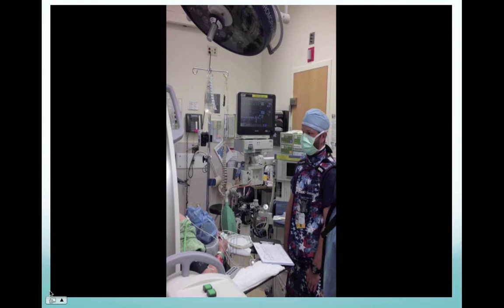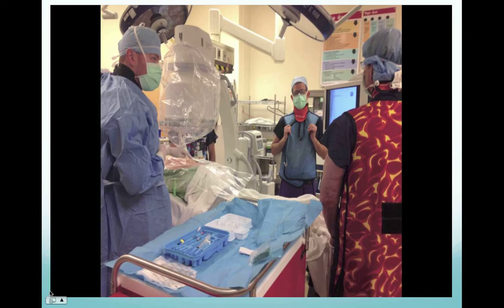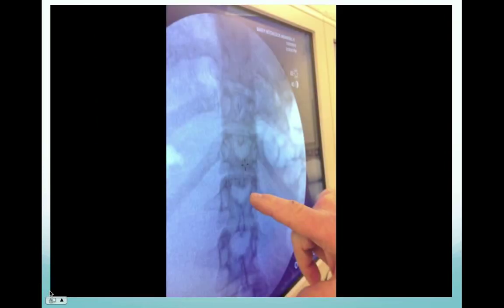Next is Matt George, one of our wonderful APS nurses who's providing sedation for this patient and also monitoring their vital signs. And lastly, here is our team in strong discussion about their upcoming case. And so the next step after getting the patient set up, we take a picture of the patient's spine just to get a general sense of their anatomy. Here you can see the target zone, which is the epidural space. That's where we want our catheter to be placed to provide pain medication. And in the next few minutes, you will be able to see the exact procedure that we go through.